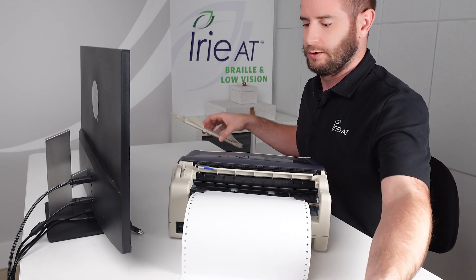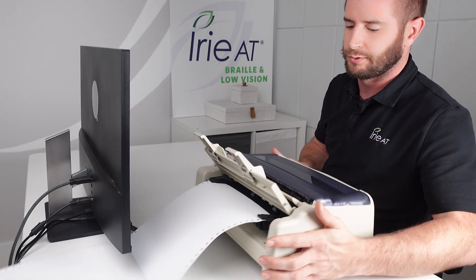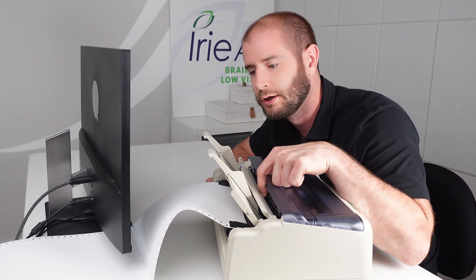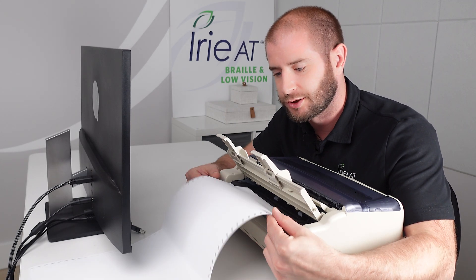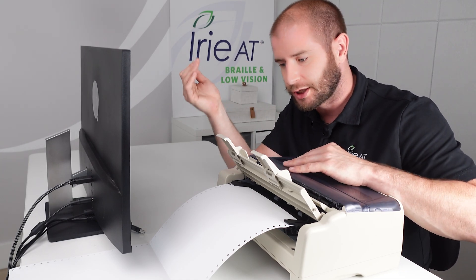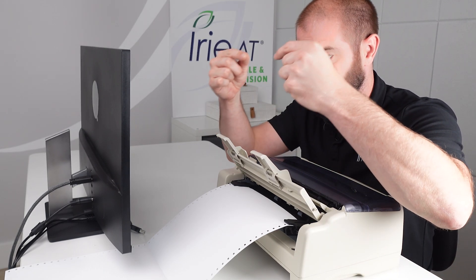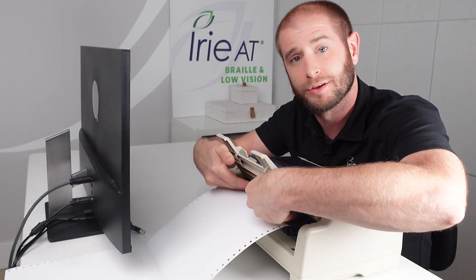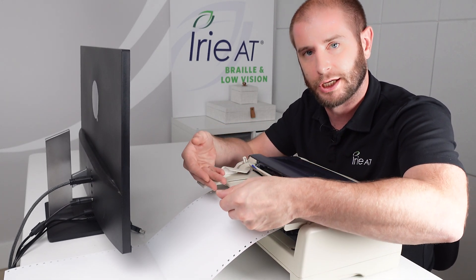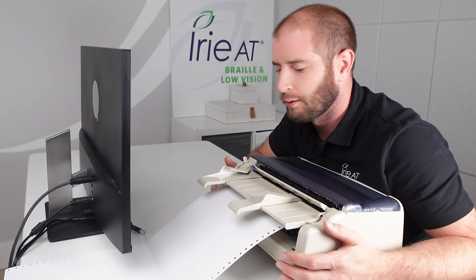Now we're going to put the paper tray on in the down position for tractor fed. This is important to know — when the paper feeds in, it's going to come out of the top slot, the same slot that cut sheet paper comes out. So if you're doing a multi-page job on tractor paper, the paper creates an arch coming through, and without the tray down, the paper can feed back into the embosser and cause problems. By putting the tray down, it forces the paper to go towards the back rather than curl and go underneath.